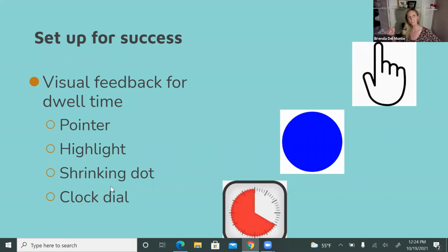So the Skyle basically talks to assistive touch within the iPad. And assistive touch is like a setting. And then the language system she was using was touch chat. Those can get a little confusing. That is an app that you would have to purchase, but you could purchase that or Loco or something else. We have both of those.